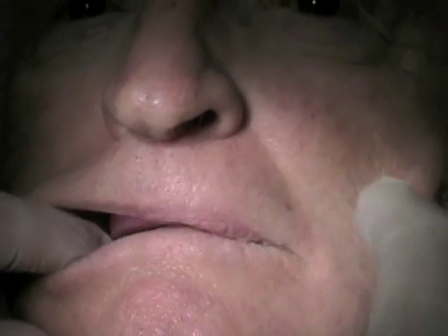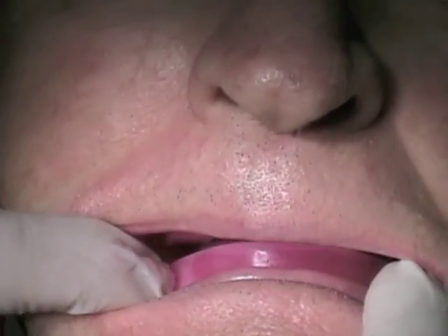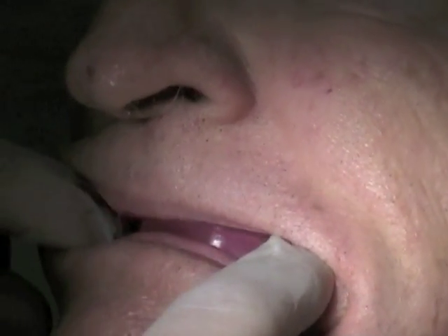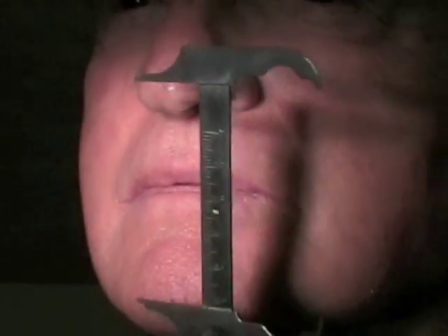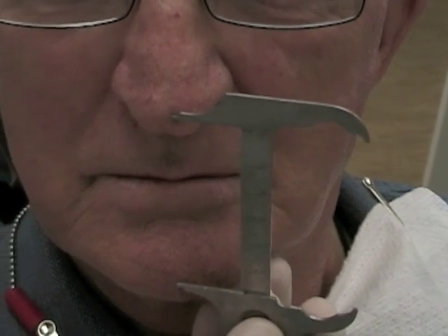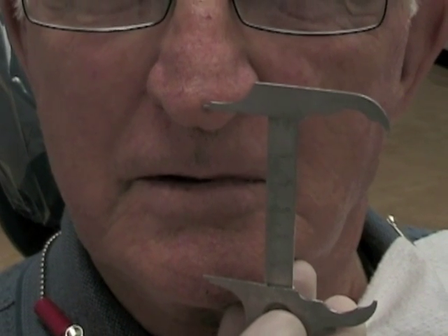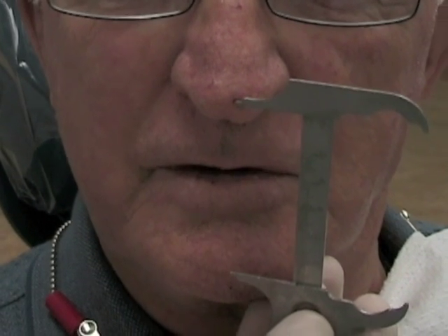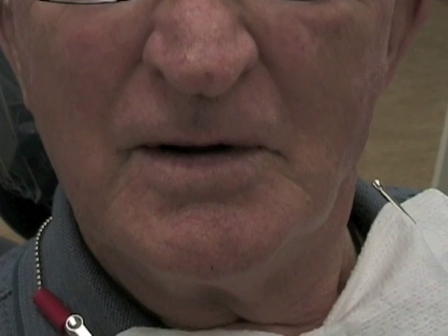Once you've adjusted both the maxillary and mandibular rims independently, place them in the patient's mouth together and check for contact throughout the rim. If there's a gap between the maxillary and mandibular rim in the posterior regions, adjust as necessary. Check your occlusal vertical dimension to decide whether to add wax or remove excess contact. Have your patient close until their lips just barely touch — that's the physiologic rest position. Then have the patient close all the way until their teeth touch — that's your occlusal vertical dimension. The difference between those two measurements should be 2-4 mm; adjust your rims until you achieve that.